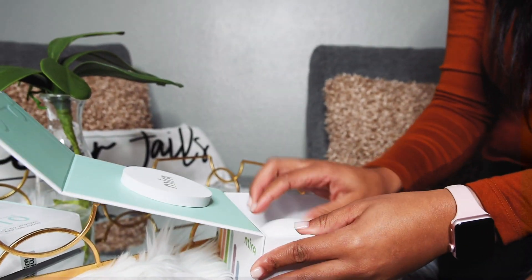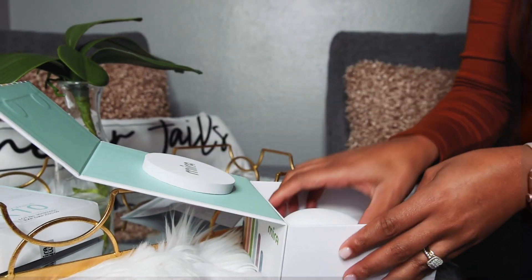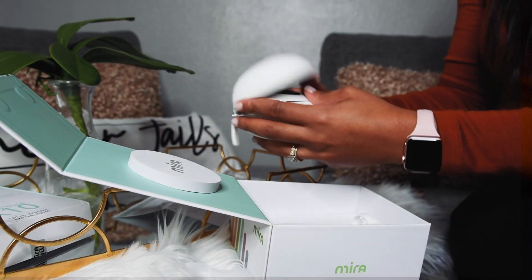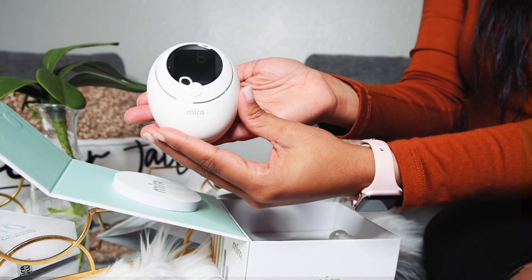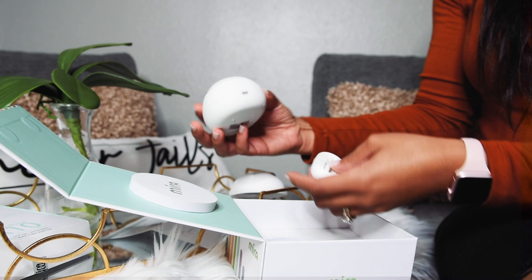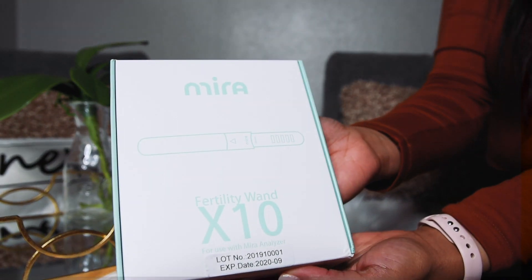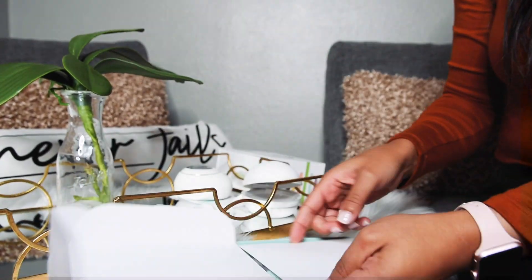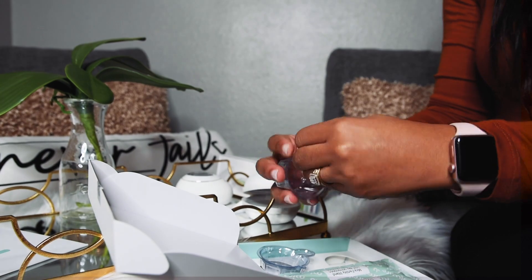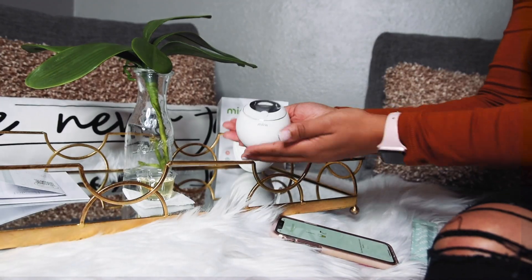I received the Mira starter kit in the mail. It came in this cute little box, along with the manual and instructions on how to set up the Mira app for the first time. It did come with a little protective case that keeps it free of dust and direct sunlight. It also came with the Mira core, but it did not come with a charging dock, so you will have to get your own. When you order the starter kit, you do get 10 free test strips, which lasted me my entire fertile window.